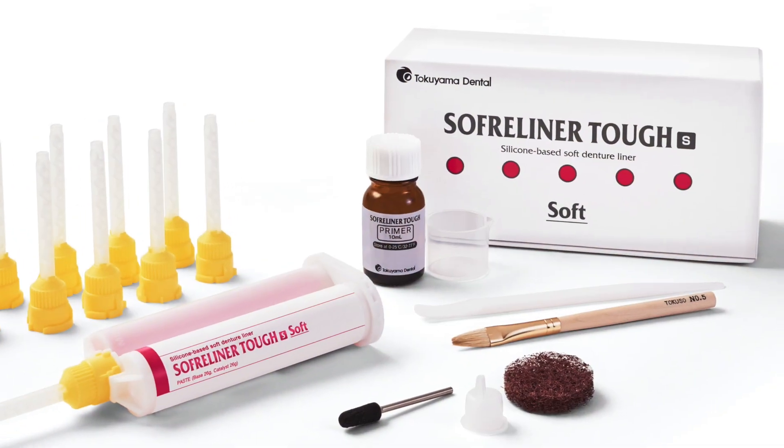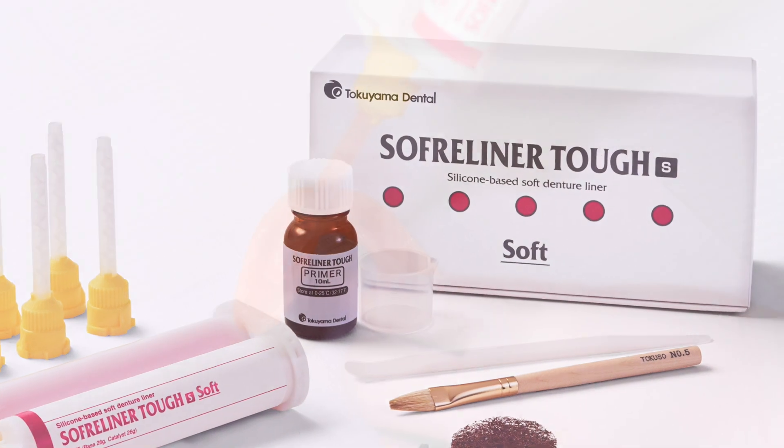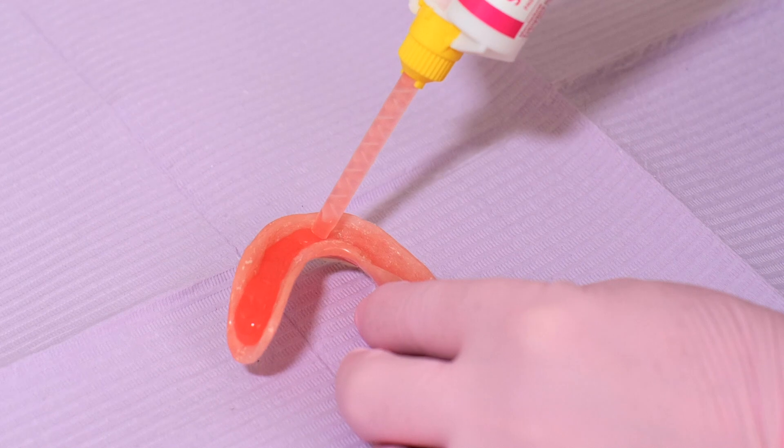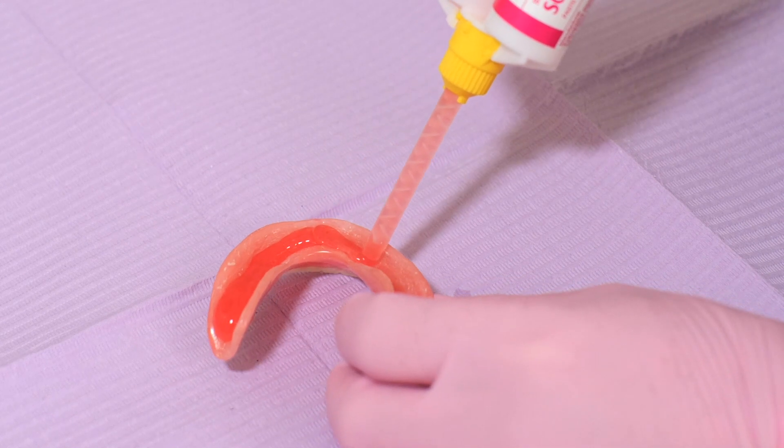I prefer the Soft Reliner Tuff soft because it allows more of a cushion and bounce against the lower arch, which typically is the one that often has most of the sore spots.